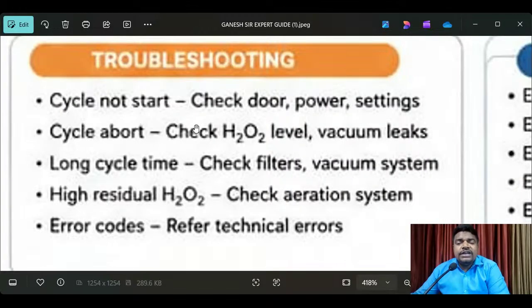Troubleshooting. So, troubleshooting what? Problems, causes, and resolutions. Very important, and every engineer also wants to know all these points as a biomedical engineer. Also, as a state regional manager working at a top-level category, many times we give instructions to engineers to resolve issues. Whoever has a doubt, come on, let me say what the troubleshootings of the plasma sterilizer are.